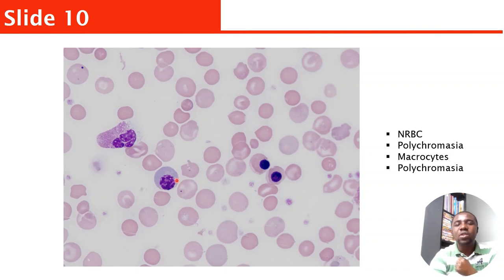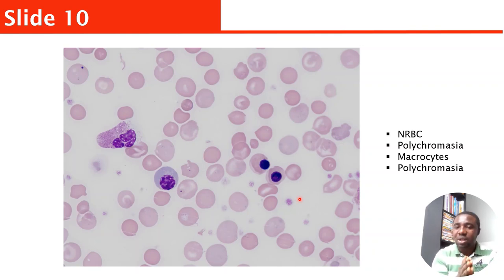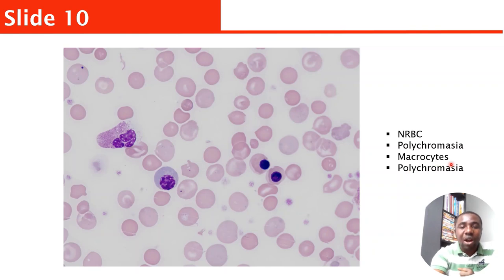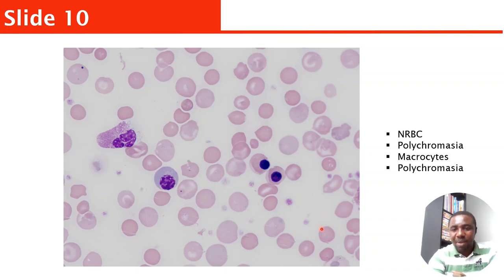This slide shows nucleated red blood cells. Once you see a significant amount of nucleated red blood cells, it means the bone marrow is under stress — it shouldn't happen normally, although it can be common in newborn babies. You can see macrocytes, polychromasia, and nucleated red cells. There are also spherocytes here, so you cannot rule out hemolysis or macrocytic anemia.